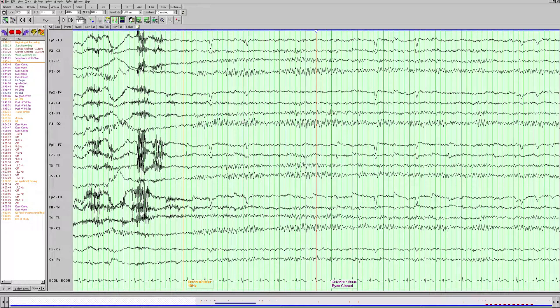The next thing we want to look at is the organization of the EEG. We look at the frequency amplitude gradient — in the front part of the head we see lower amplitude and faster frequency activity. As we move toward the back of the head, we see the amplitude getting larger and the frequency slowing down. So this is a very nicely organized EEG.